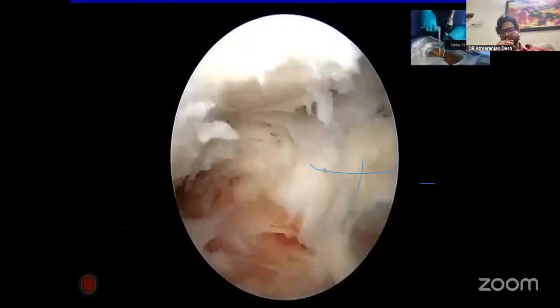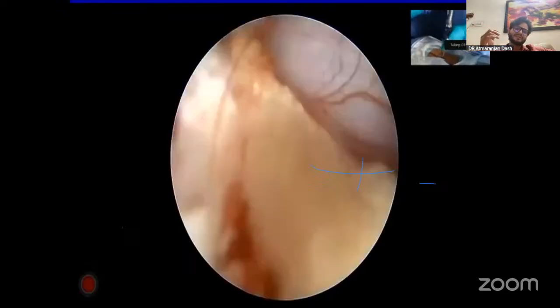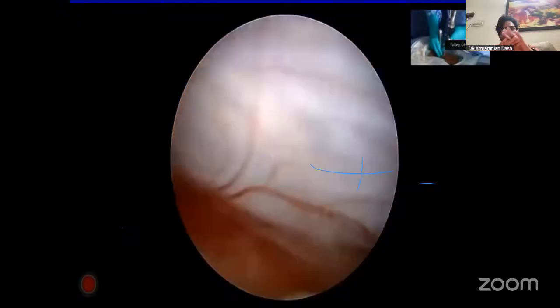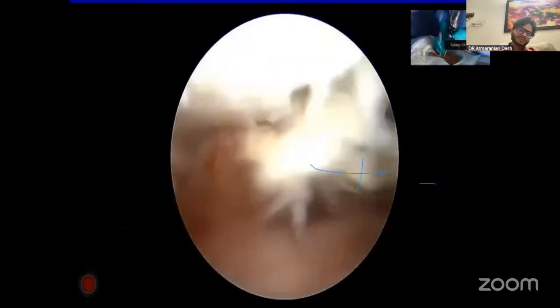That is why endoscopy is unpopular, or people say it doesn't have results, but with biportal we can access those blind spots very easily because of the 4 mm scope. The 4 mm scope can travel underneath the lamina and can remove those blind spots. I'll show you the blind spot.